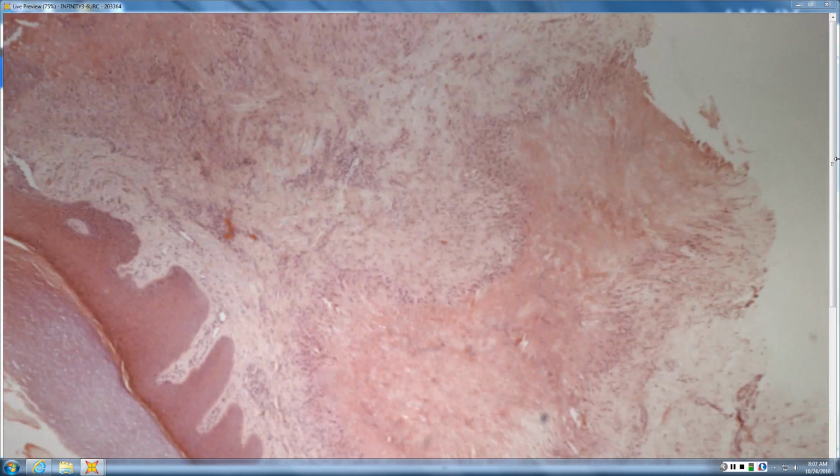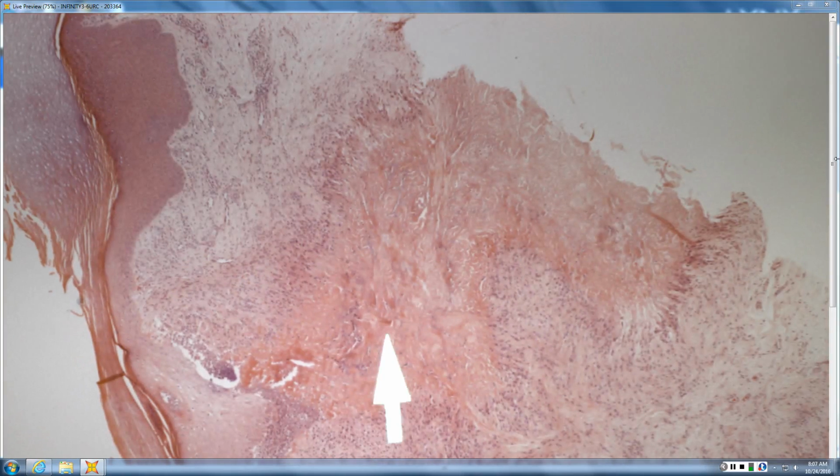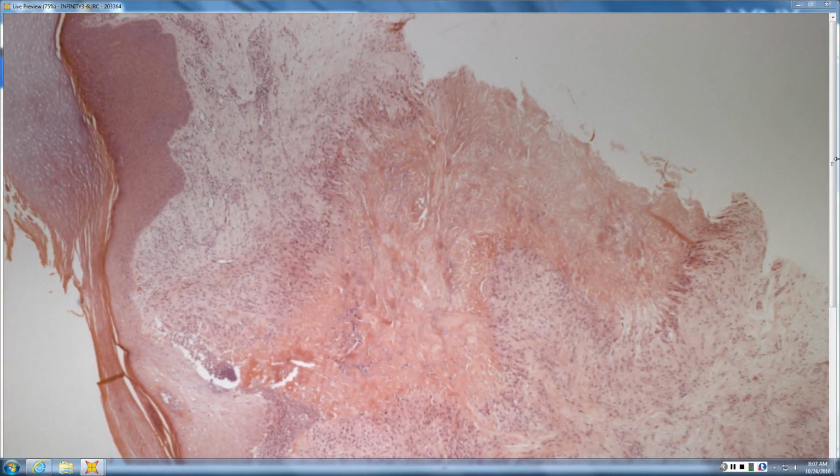So, palisaded, I don't know if that's fibrin or actual caseous necrosis, but... So does it appear more or less intense than the surrounding dermis? More intense, so it's likely fibrin. Right. So palisaded granuloma around fibrin, so you were thinking? Well, it would be either rheumatoid nodule or deep GA.